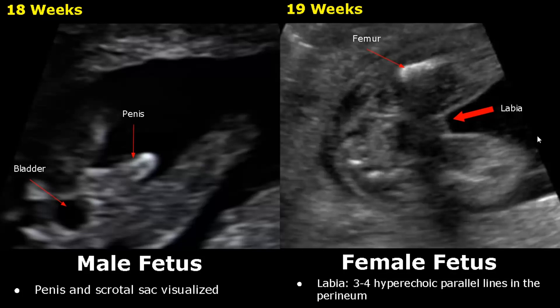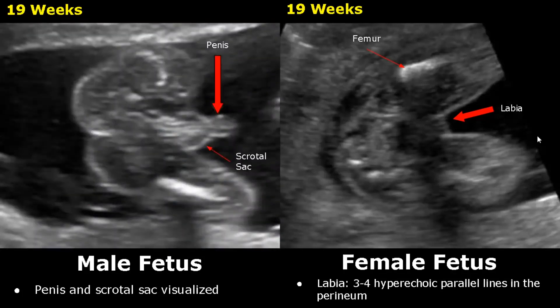As the fetus grows, the genitalia become more prominent and we can see them more easily. Here is a 19 weeks male fetus. We can see the penis and the scrotal sac more clearly.